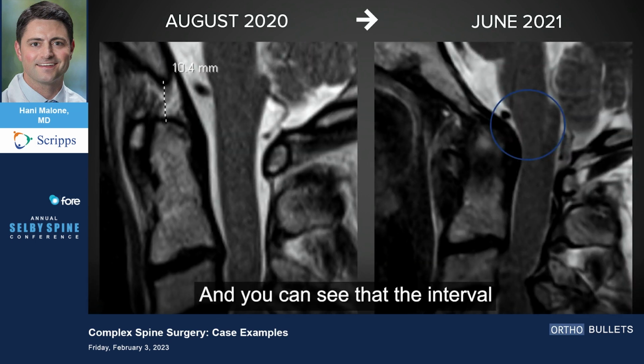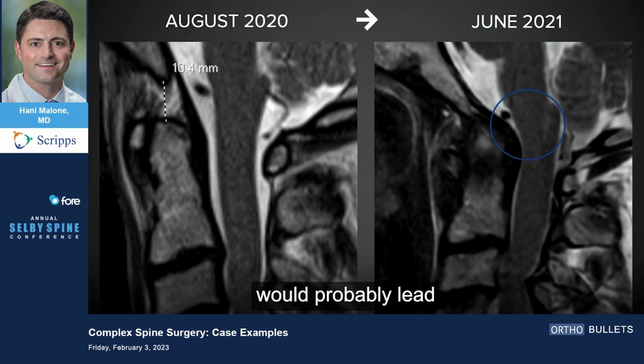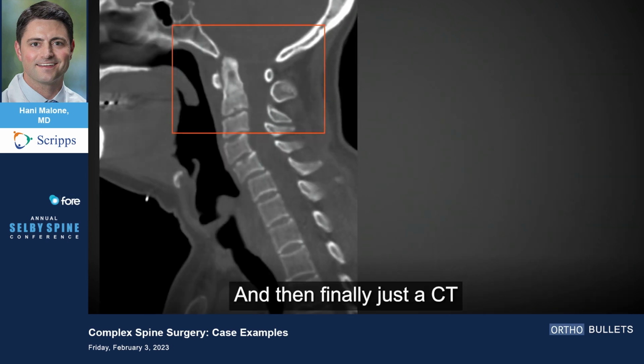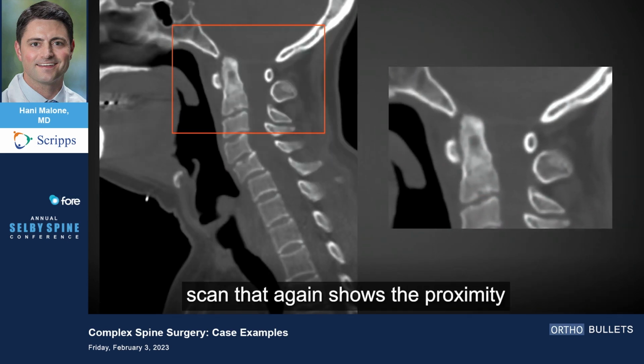And you can see that the interval between her odontoid and the basion went from over a centimeter to essentially nothing, and then the medullary kinking that resulted, which probably led to most of her severe myelopathy symptoms. And then finally, just a CT scan that again shows the proximity of the odontoid to the basion.